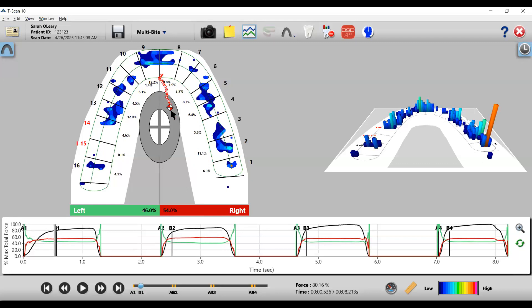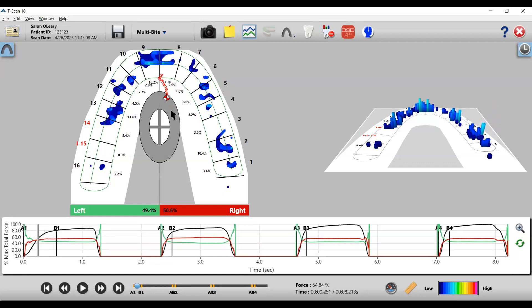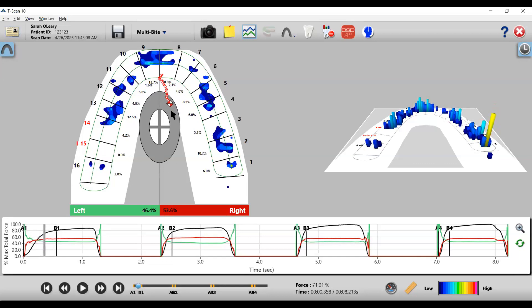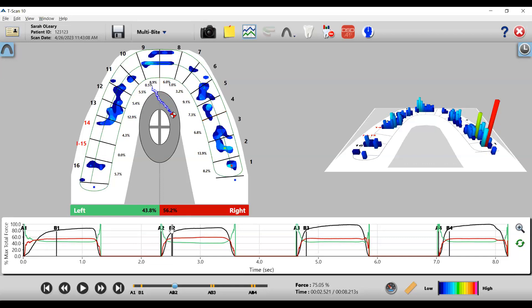It's kind of like a tug of war between the right and left side, where the right side is winning because it's more forceful earlier. As we continue to play through, the center of force stops moving — it comes into a static position. That's called the resting place, or static intercuspation. At that point, the patient has completed the bite. Looking at the second bite, it moves in a similar direction from anterior left to posterior right — kind of the same diagonal — and comes to rest in a similar place as the first bite.